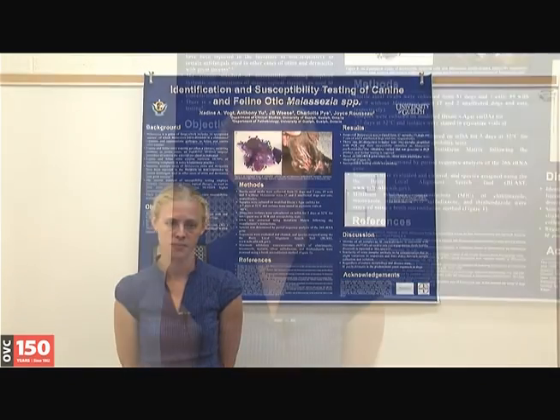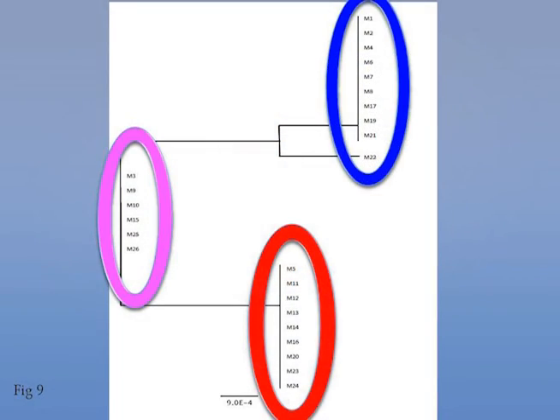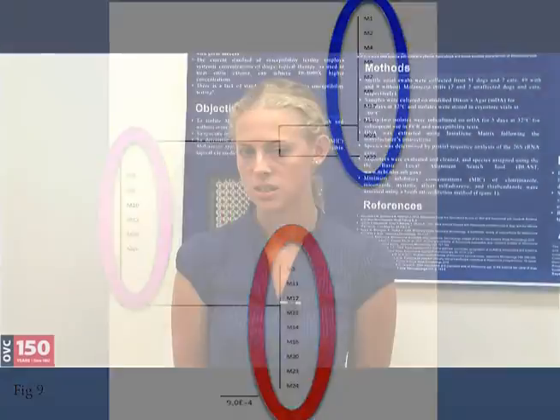Suspected Malassezia was isolated from 37 of 58 animals, including 35 dogs and 2 cats. Of those samples, only 4 were unaffected dogs. 26 samples were successfully amplified with PCR, and 25 of those were identified as Malassezia pachydermatis. The remaining sample is currently being sequenced. Based on the sequences from the 26S rRNA gene, 3 main phylotypes were identified. And based on preliminary work, there was no obvious relationship between phylotype and severity of clinical disease. This result awaits confirmation with pending susceptibility testing results.